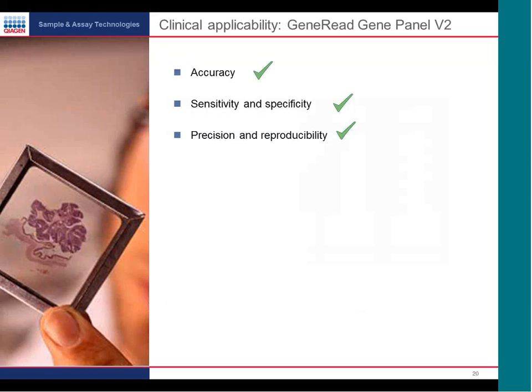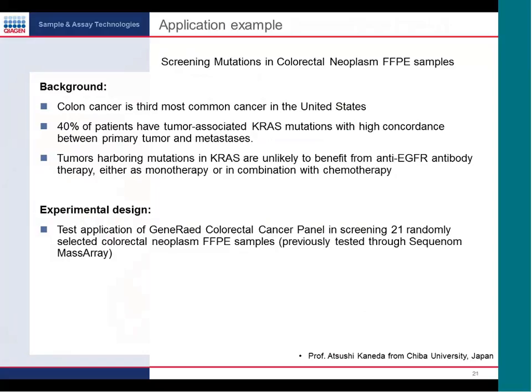So basically, after this test, we have ensured that we have high accuracy, sensitivity, and specificity, as well as precision and reproducibility. After confirming this, we went ahead and did a short case study in which we used our colorectal cancer panel to do the screening in colorectal neoplasm FFPE samples.